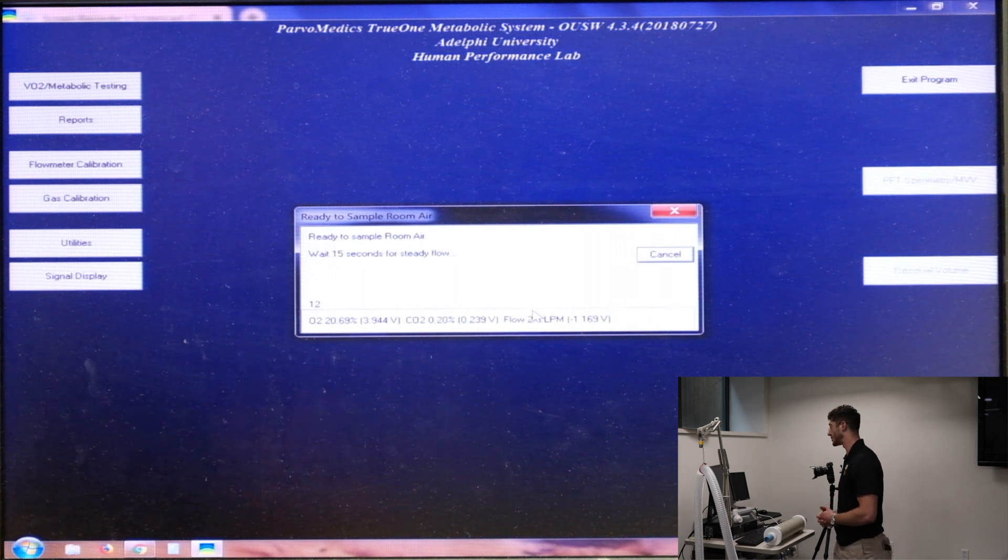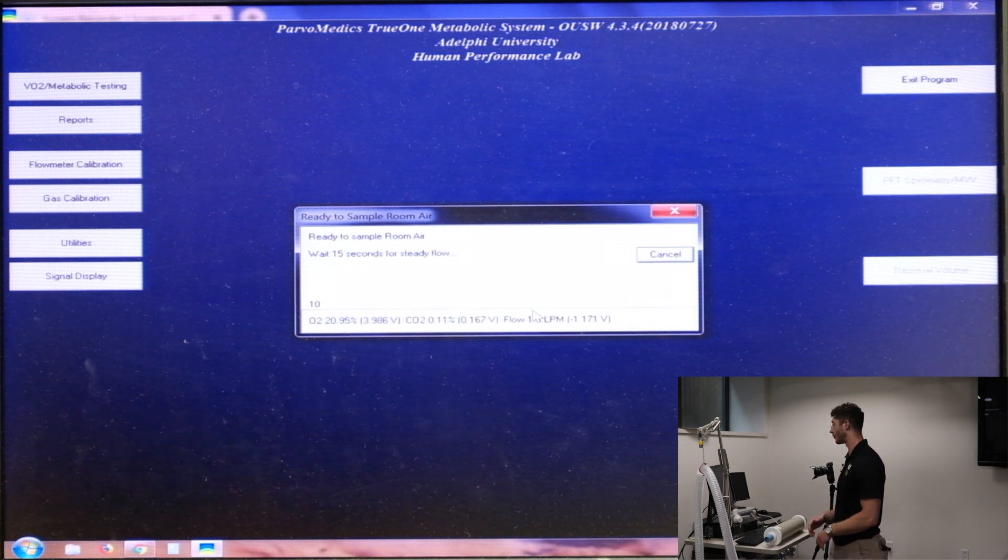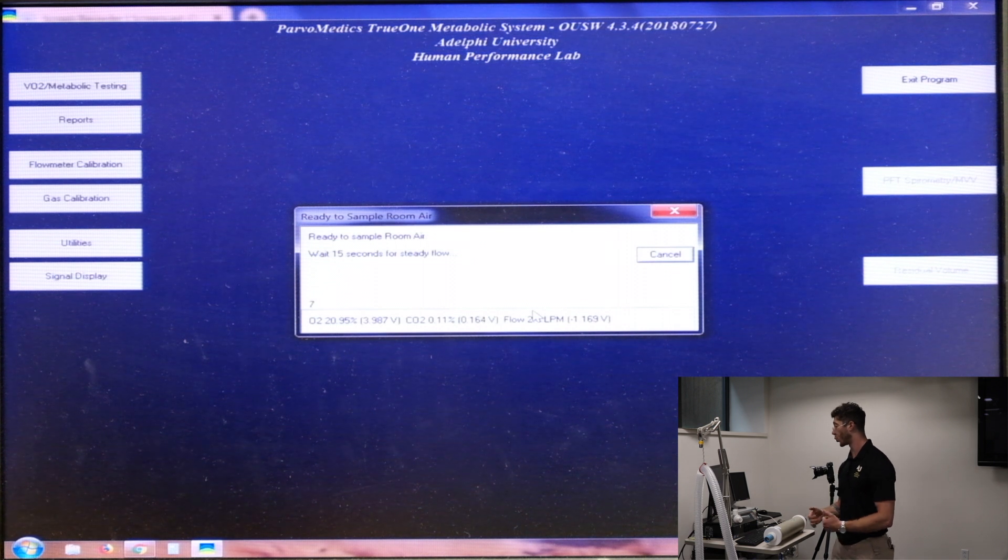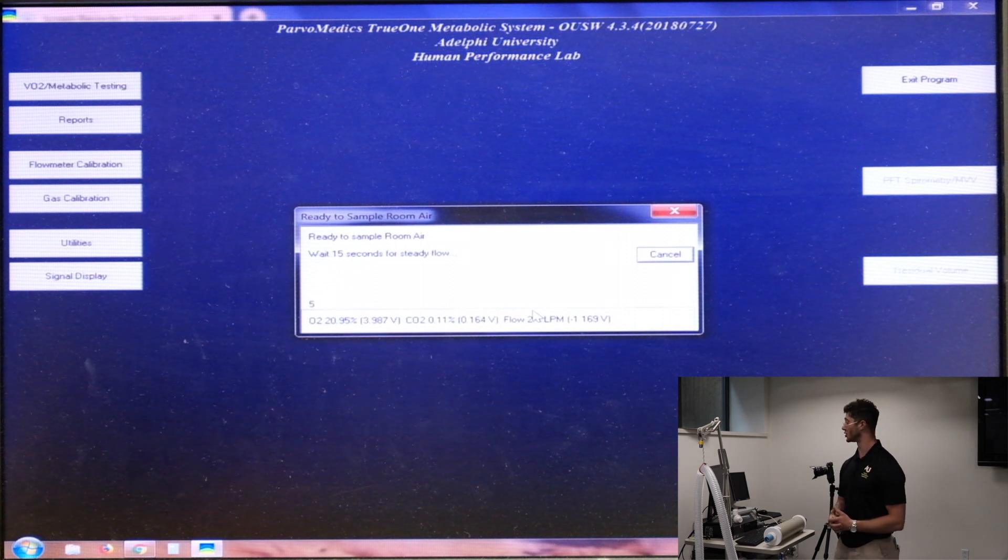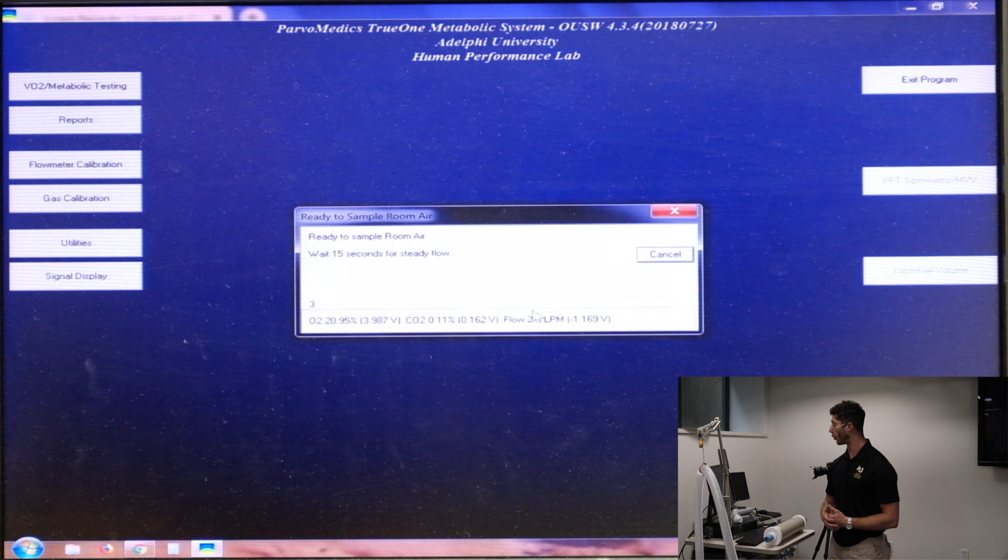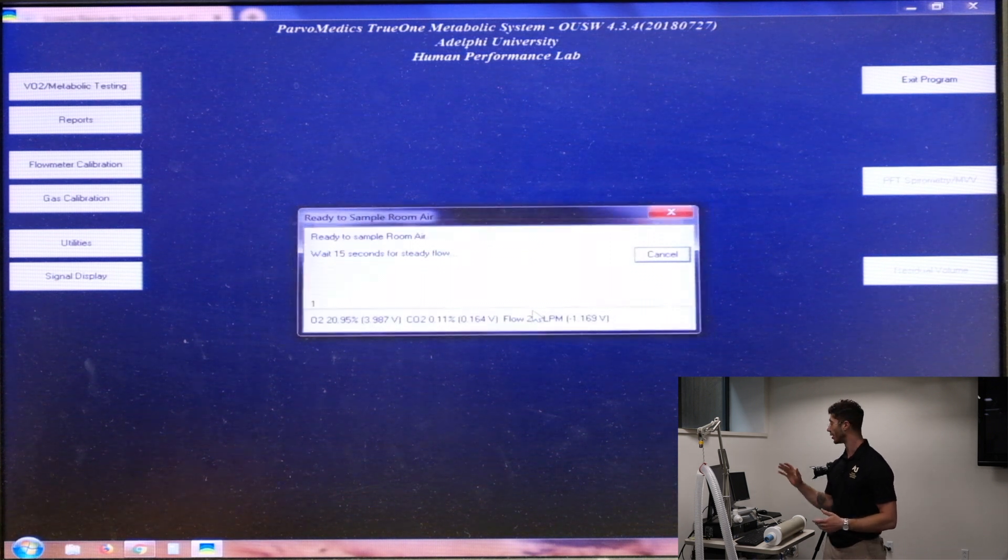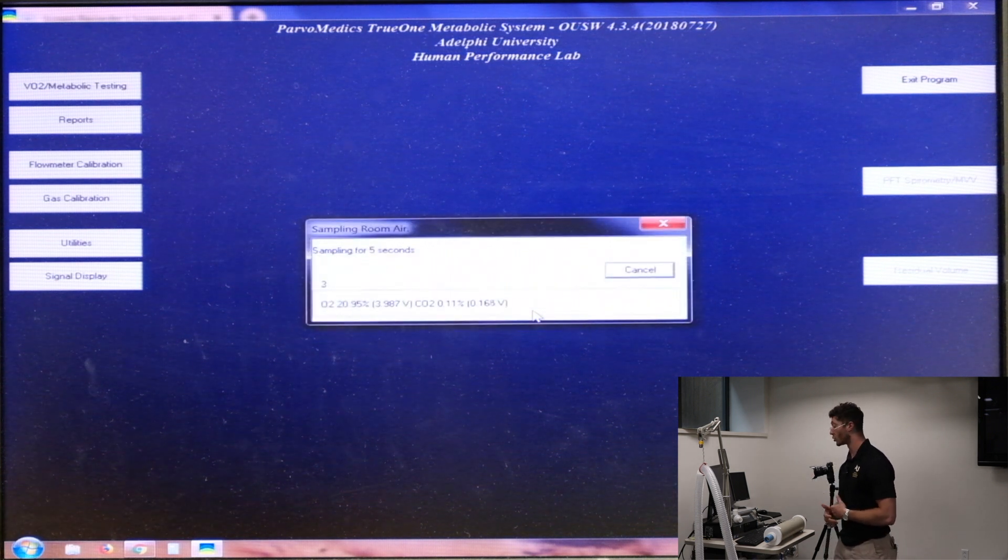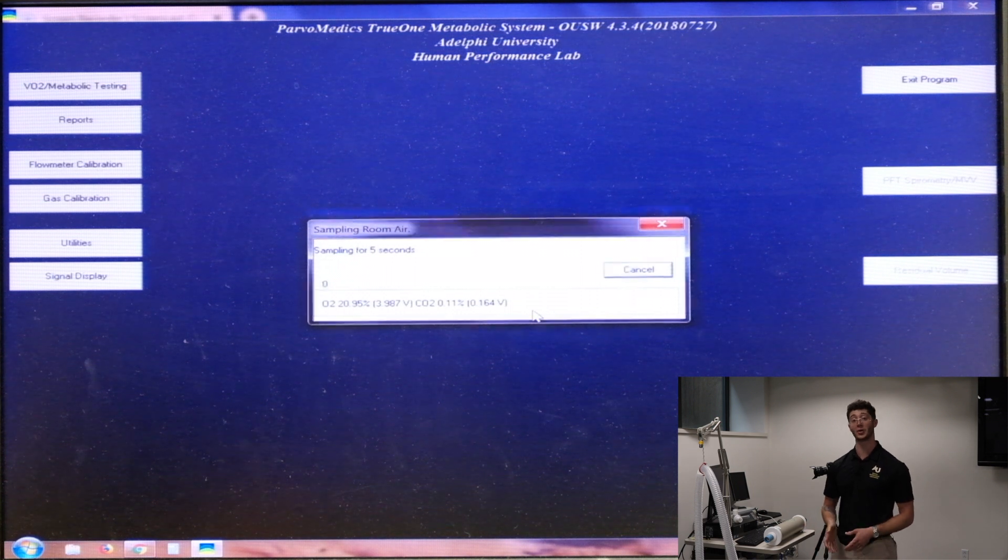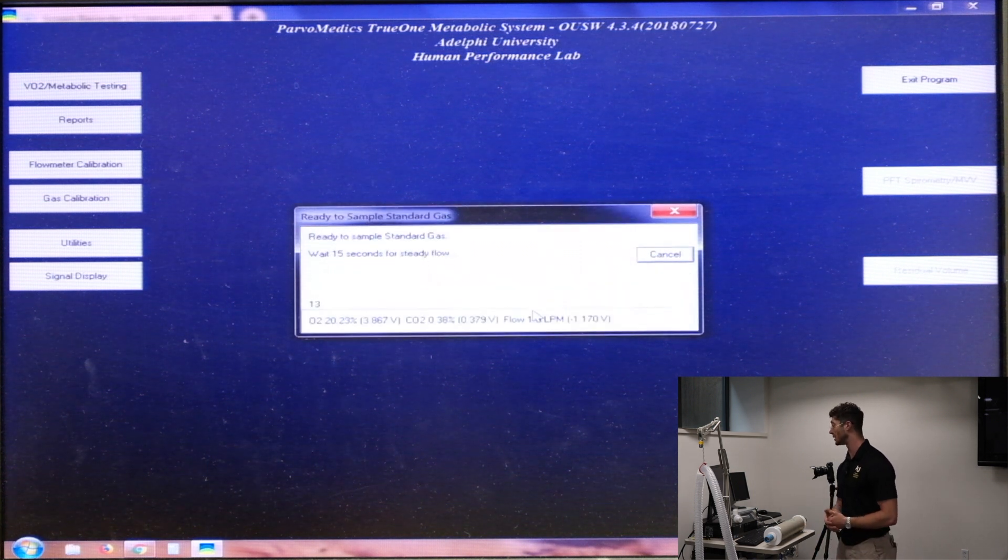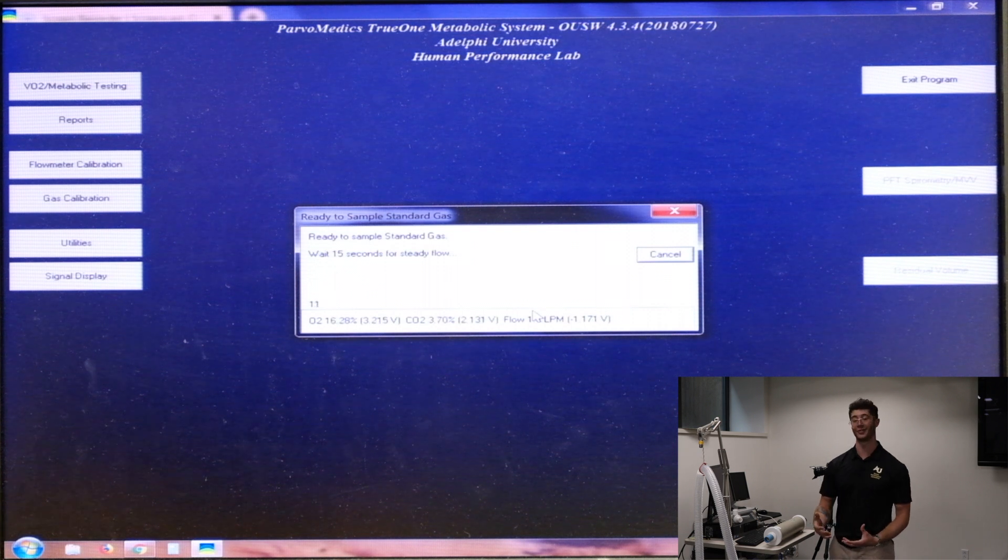So as you can see, you're going to see some varying levels, but it seems to be stabilizing around 20.95% oxygen and 0.11% carbon dioxide. So we know those values are not what we're supposed to be seeing at sea level, and so there is going to be a correction factor.